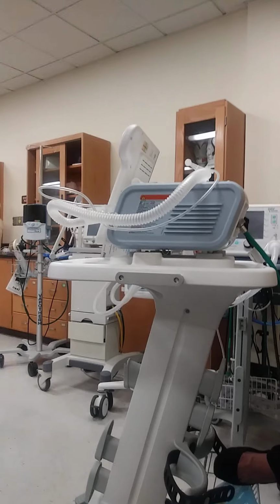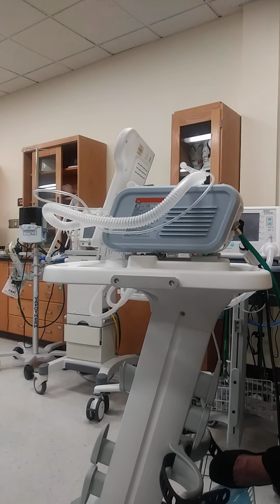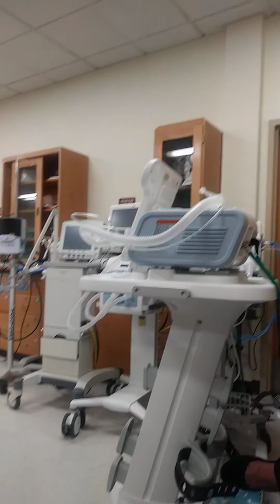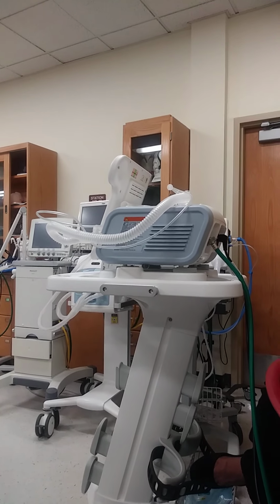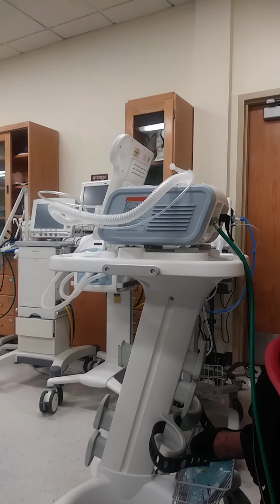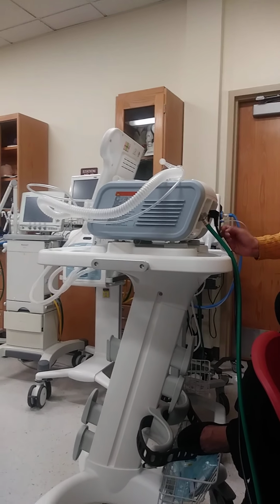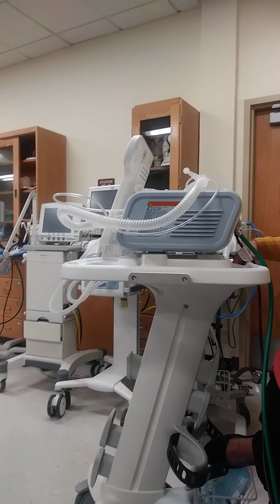Yeah. He's able to, if I explain to him how to take off the mask, he can take it off. I have a patient who got diagnosed with TB, and they're coughing up tons of blood. No, I can make it worse, right? Coughing up blood is hemoptysis. Another thing is if they have a lot of secretions, we usually don't put them on it as well. I'm talking copious amounts of secretions, because then they can aspirate on that. Look at your vital signs. All right.